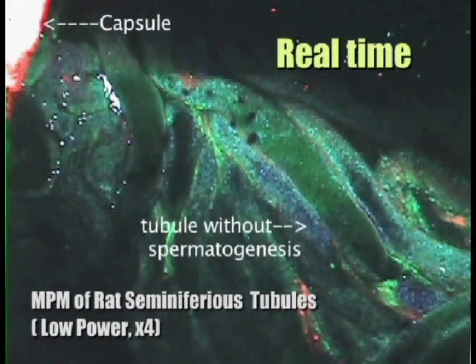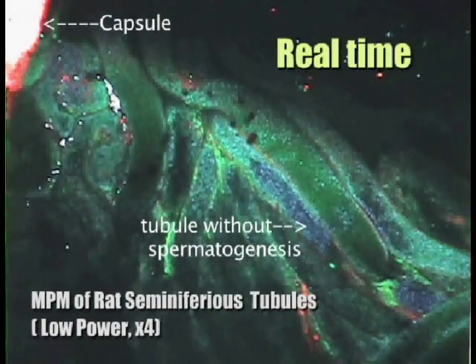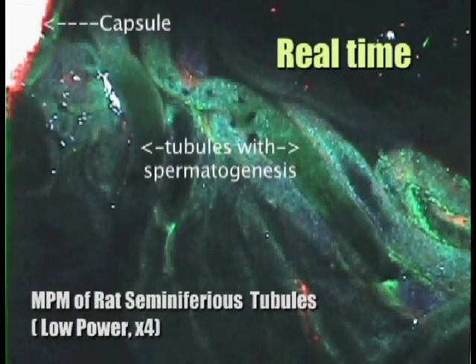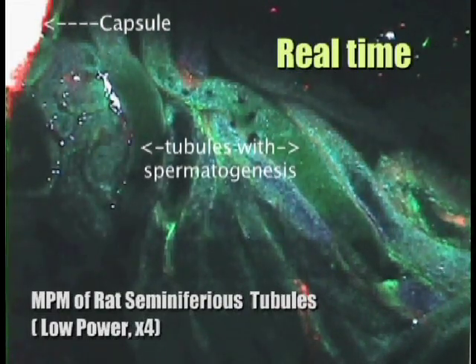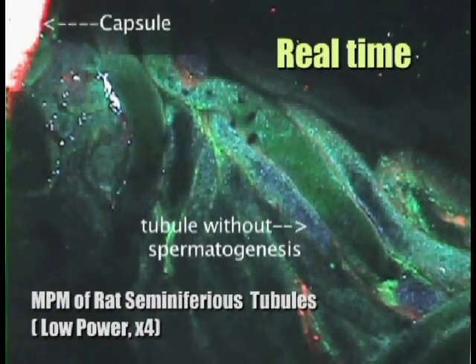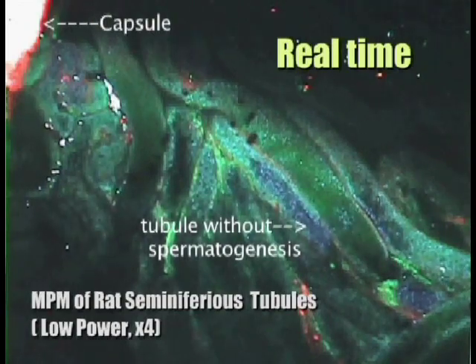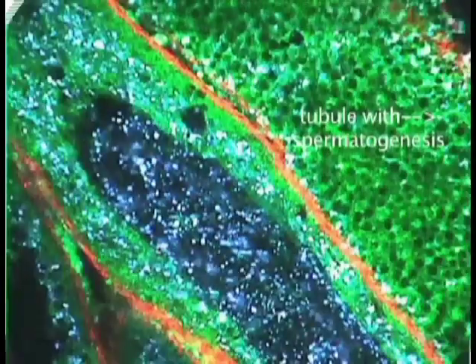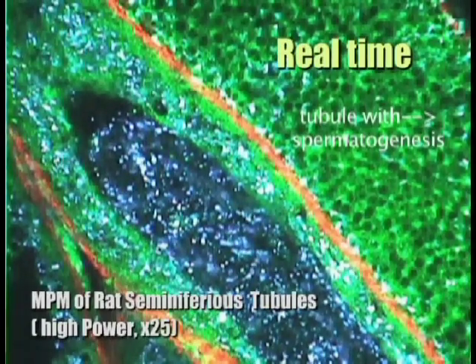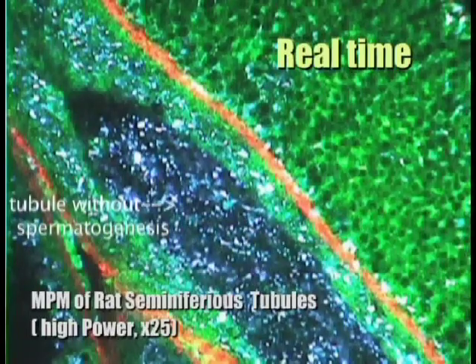This video segment reflects the real-time imaging of the testes under MPM at low magnification, 4X. Shown on the left top corner is the capsule. The two tubules with spermatogenesis are evident in the middle, whereas the tubules in between are smaller and most likely contain Sertoli cell only histology. Under high magnification at 25 times, we see the tubule on the right with spermatogenesis, and the tubule on the left without spermatogenesis.